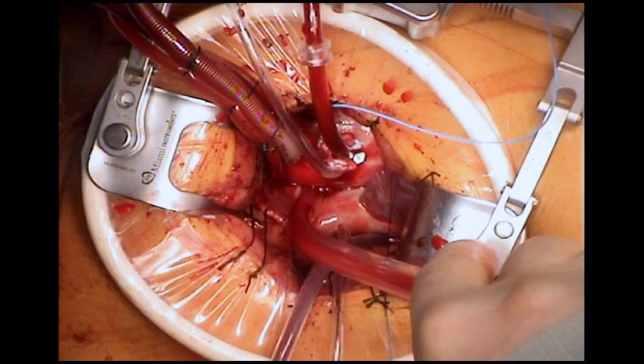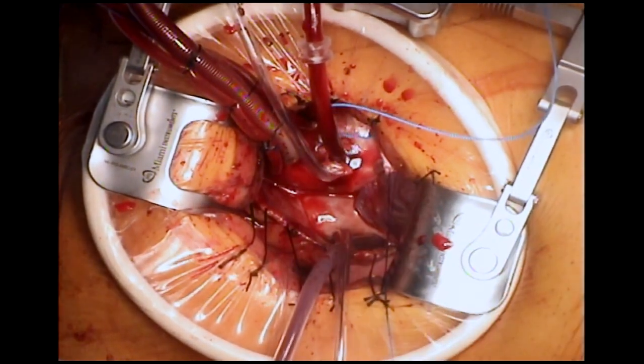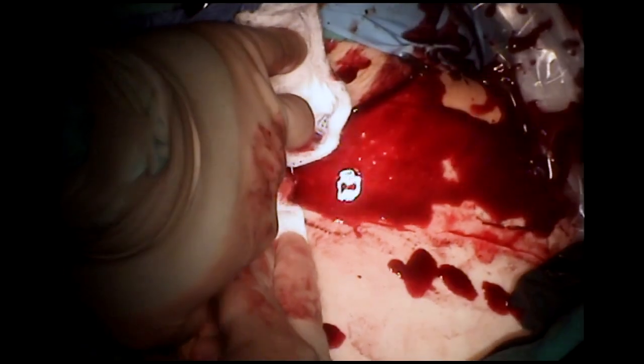A right ventricular pacing lead is now placed, and following this the patient is weaned from cardiopulmonary bypass. Echo is used to confirm that the valve is well seated with no issues.